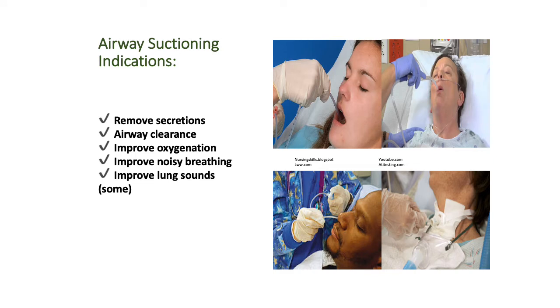Indications for airway suctioning include removal of secretions from the airways, providing airway clearance, improving oxygenation for the patient, improving noisy breathing, and if it's a deep type of suctioning, it will actually improve lung sounds as well.